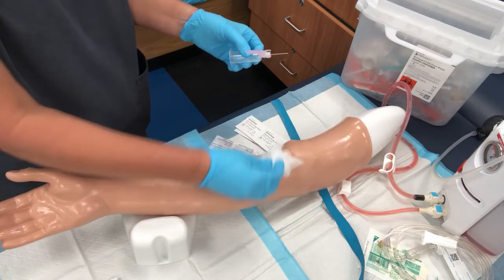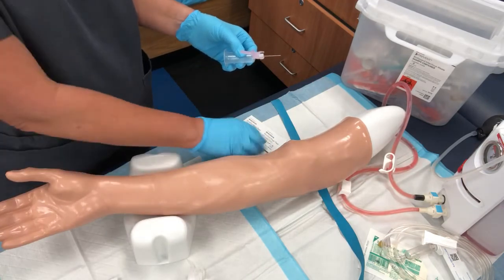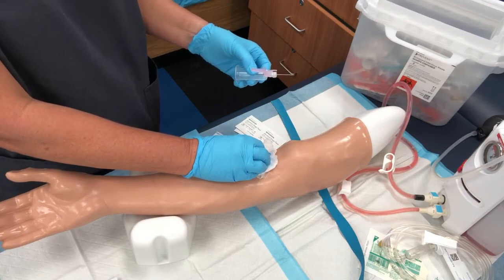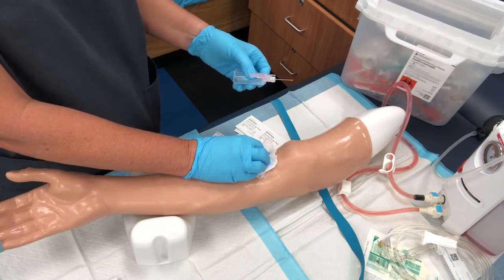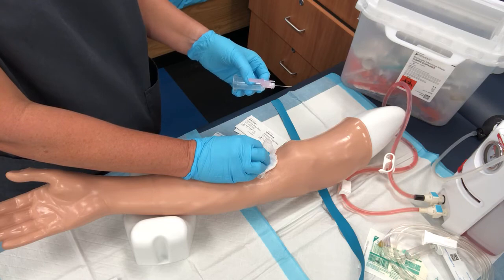Now that I know that my patient's okay, I'm gonna go ahead and put a Band-Aid on them. If this was an older adult, I would keep the gauze on and then typically wrap this with Coban, just so that they don't have to worry about having any type of tape to their skin. Not so much about the risk for any allergies, but more so the risk for skin tears for that patient.